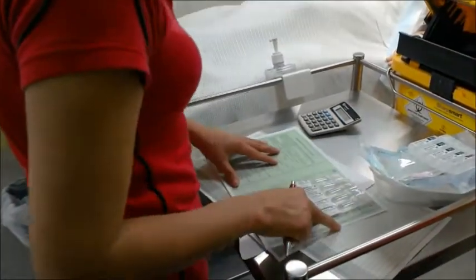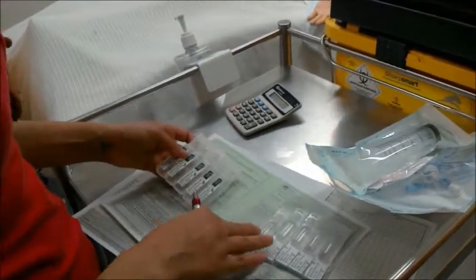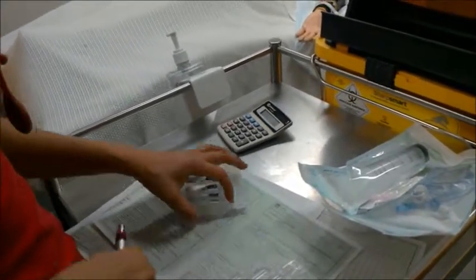So I'm going to do my first drug check with you. Would you be my second RN to do it? Yes. Okay. And this medication is compatible with 0.9% sodium chloride. That's what my order says.